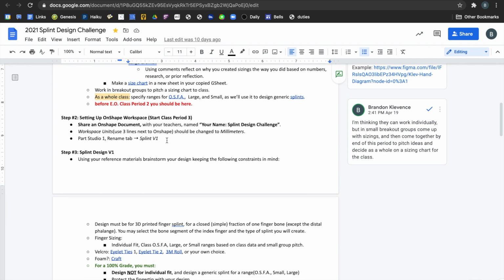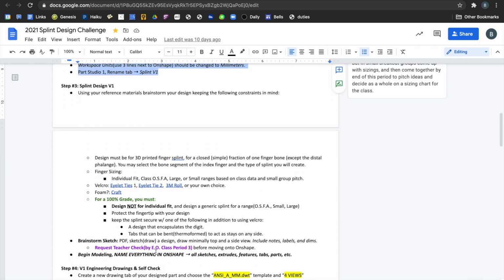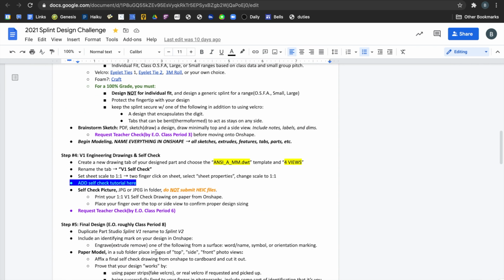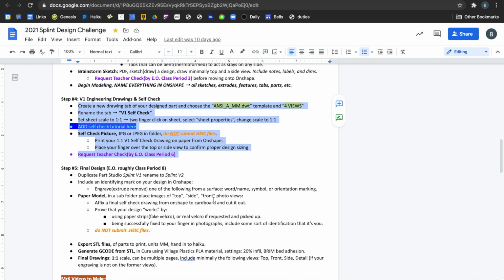So you're going to be working in Onshape, you're going to be designing a splint, and you're going to test it out on a sheet of paper. Eventually you're going to make sure it looks good, and I'll show you how to do that self-check, and then you are going to submit a final design of a splint and try to make a paper model of it. We'll also 3D print your model for you.